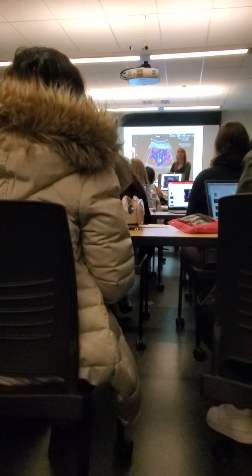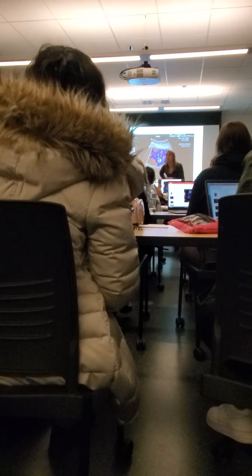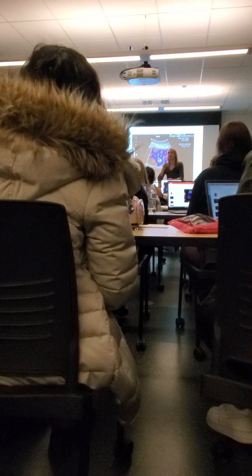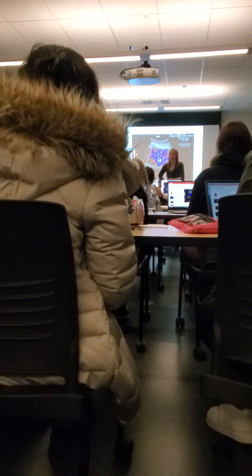And this is part of a retroperitoneal limited. Pardon me? This is part of our retroperitoneal limited. So in the real world, we call them renals, but when they're ordered, they're ordered as a retroperitoneal. They never call them renal exams, we call them renal exams. And these are your favorite exam that you're going to do.